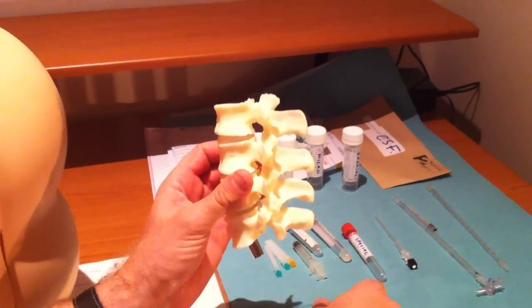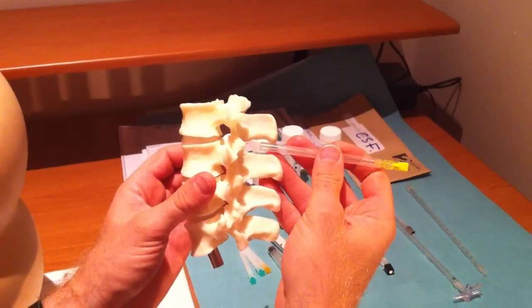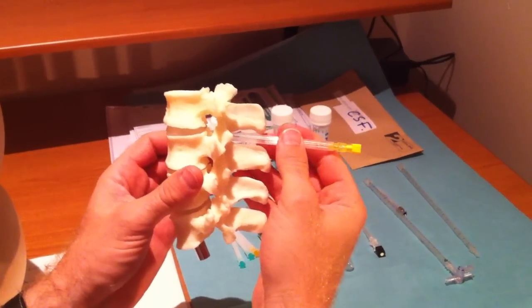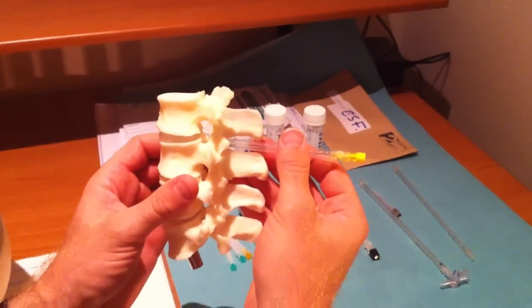If you know that anatomy and you're in between the spinous processes with no bony resistance, you basically just keep pushing the needle in with confidence until it's about two thirds of the way in, and at some point you should get CSF.